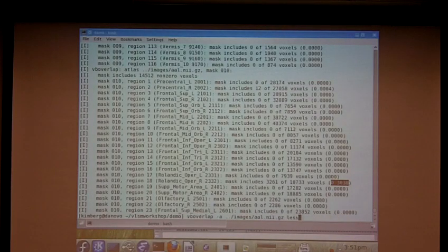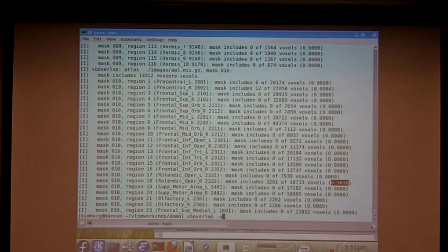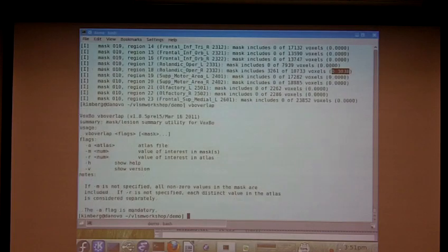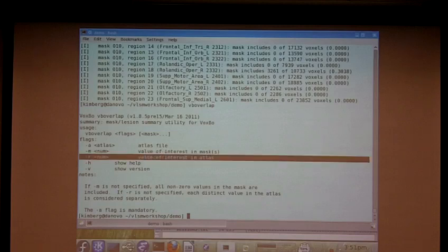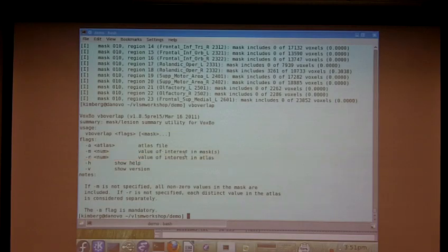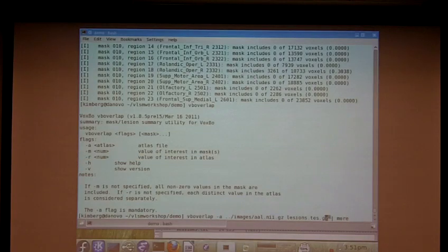I'll be the first to admit the output here is not incredibly user-friendly. There is one thing that you can do that does help, which is if you're interested in this particular region, you can specify it here using the dash R option. So if I repeat that but say dash R 18.